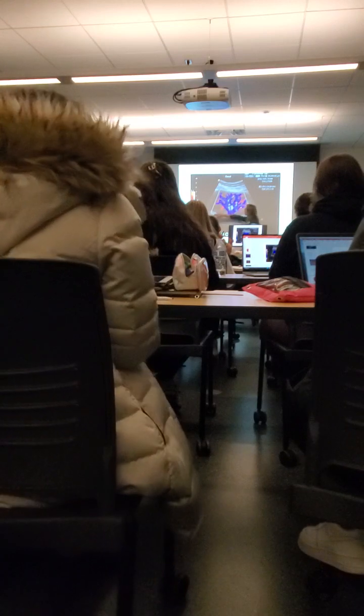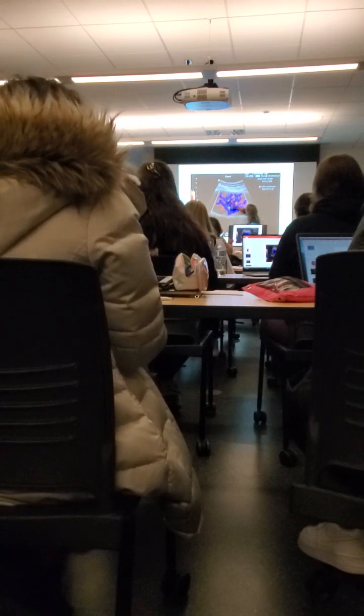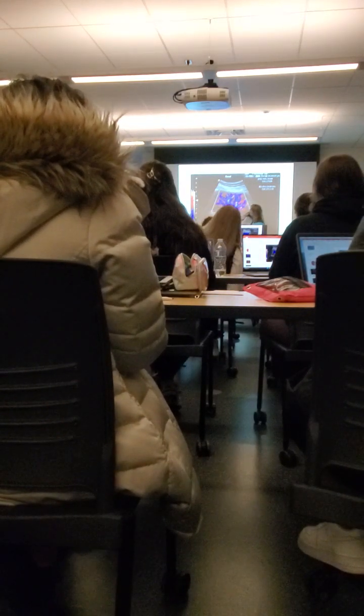So this is what we call the tree of life. And when we do a renal ultrasound that's specific to the kidneys, we're going to get this image. If I'm just imaging my kidneys with my abdomen exam, I'm not going to worry about this image. But when we actually are evaluating the kidneys themselves, we're going to get this. Now, blue is going away from my transducer, red's going towards. So are blue my veins or my arteries?